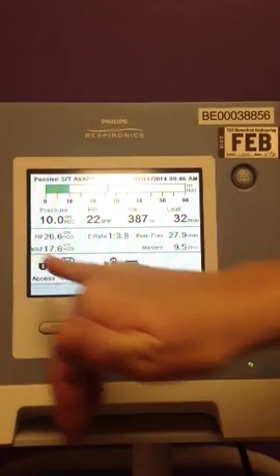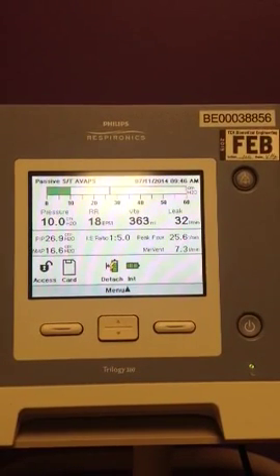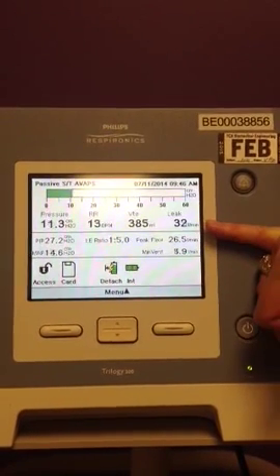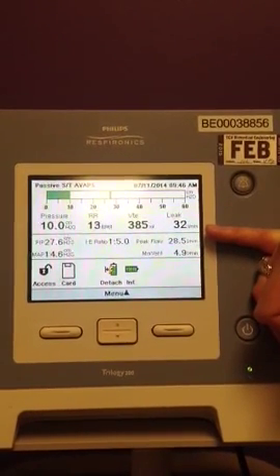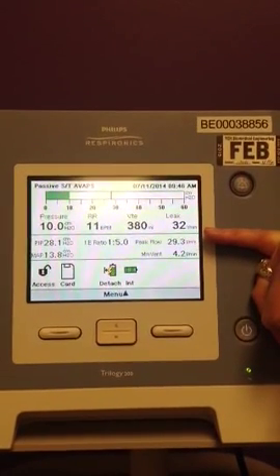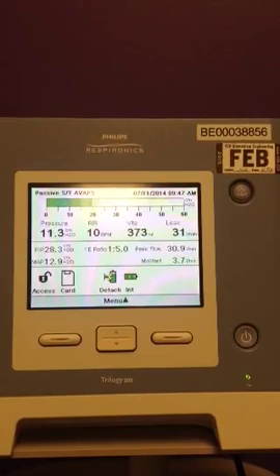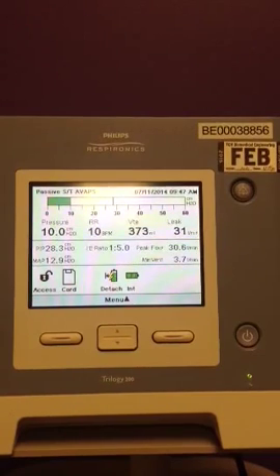The next line we come to gives us feedback from the patient. These are patient parameters. These parameters here give us a calculated value of what the patient is doing. And I say a calculated value because we're in the passive circuit, there is nothing that's actually giving feedback of measured parameters to the ventilator for it to display. It gives a calculation based on the leak, based on the flow, and based on how much tidal volume is being placed in, that it kind of senses the values and gives you a calculated value.